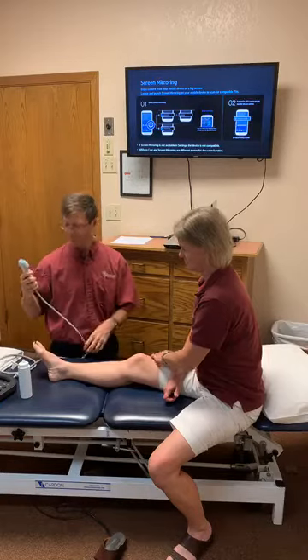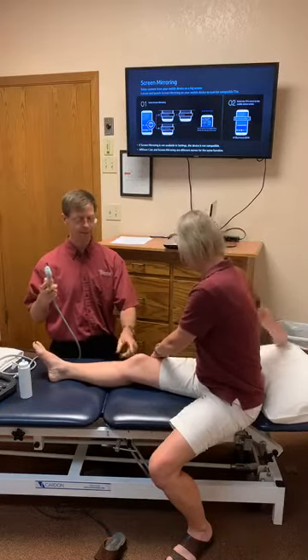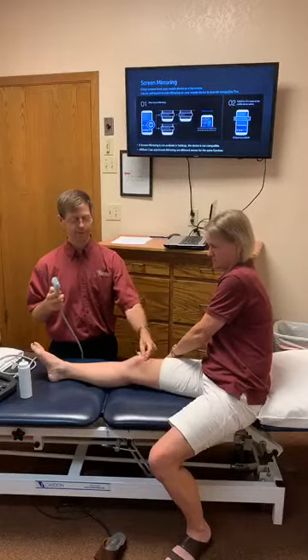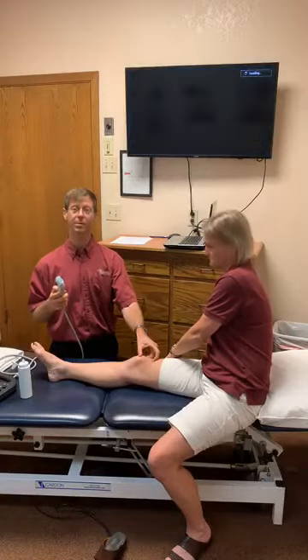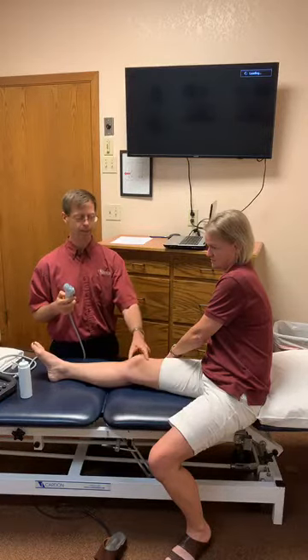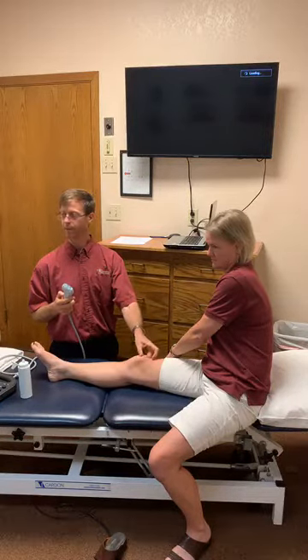So what we're going to do is we're going to look at the knee here. We're going to start by doing a little bit of a look up here at the quad tendon. We talked about tendonitis, so we'll be able to evaluate and look at the knee here. We'll see part of the kneecap.